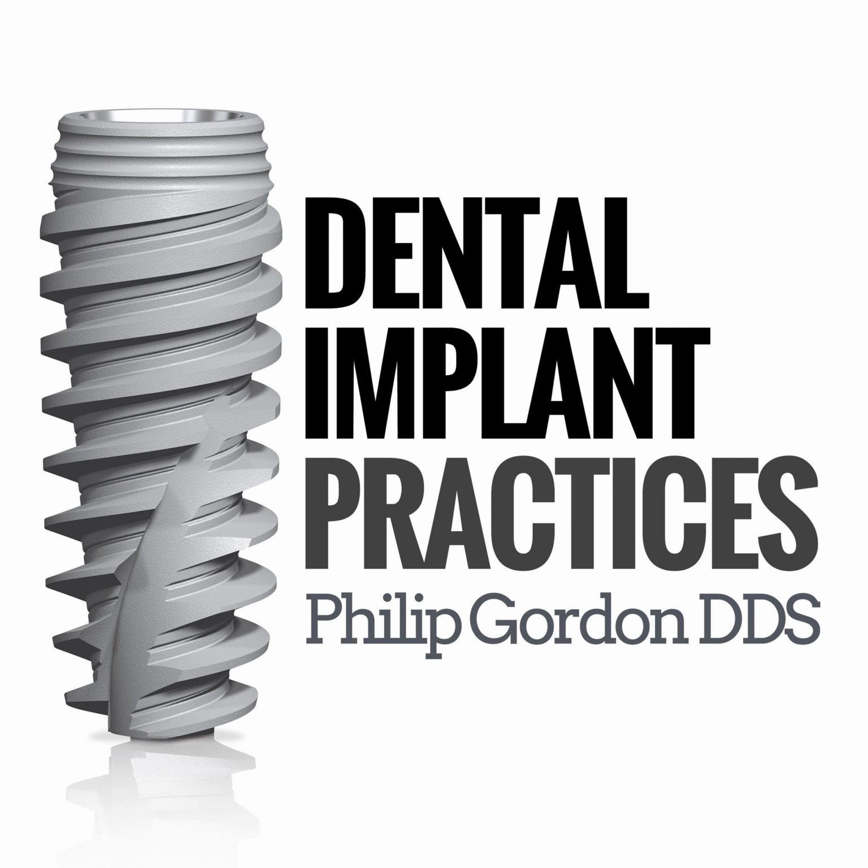Now, when I first started hearing about sinus lifts, everyone said, "Oh, you can't tear the membrane. If there's any tear or hole in the membrane, it's disaster." I think we know now that that's kind of not the case. You can have small tears in the membrane, you can have small perforations, because in a healthy membrane, sometimes it's very hard to lift. It doesn't separate easily, and sometimes you do get small tears. So what I'll do is I always reinforce the roof of my sinus lift with a collagen membrane, and then I graft with freeze-dried particulate corticocancellous.